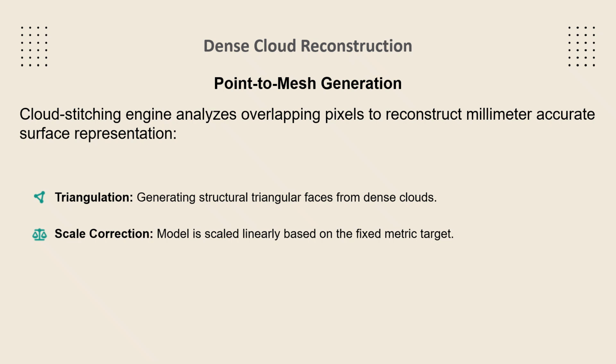When locating the boundaries of the 5 cm target marker within the virtual space, the software determines the pixel to millimeter ratio and applies a linear scaling matrix to the model. Using this method, a very accurate digital twin is produced that matches the real arm dimensions of the patient within a millimeter margin of error.